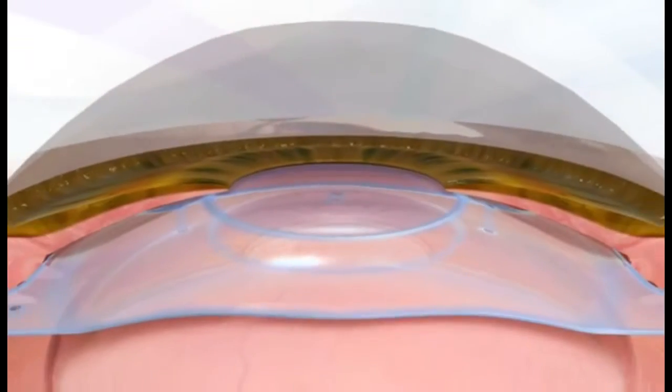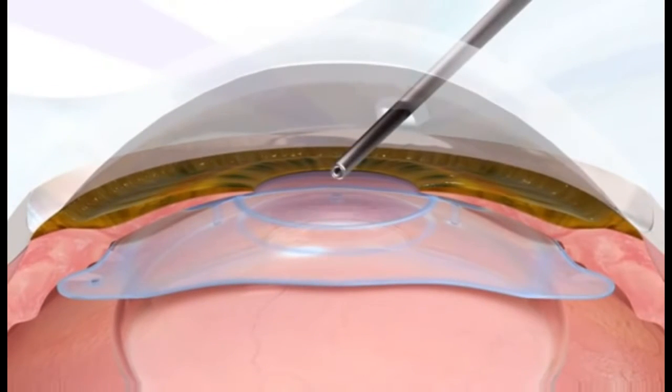As an added benefit, irrigating through the KS Aqua port to flush viscoelastic into the anterior chamber may facilitate viscoelastic removal.